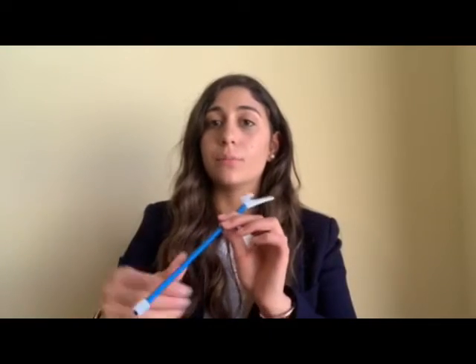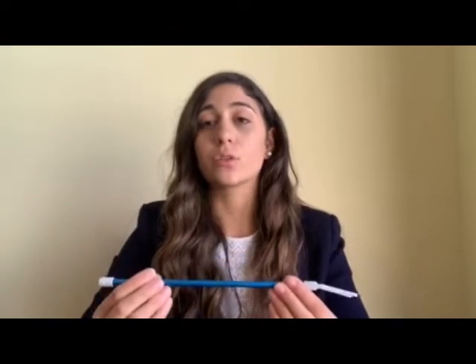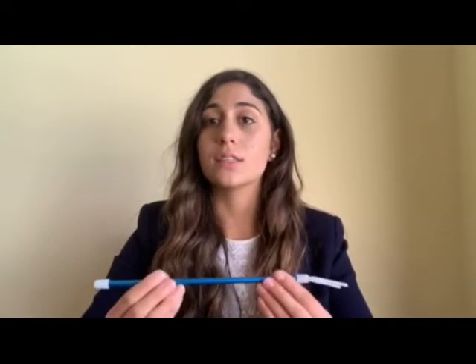These patients spend most of their day in a hospital bed with little to do. They do have an iPad set up in front of them that they can use for entertainment, research, and reaching out to family and friends. Currently, they access this iPad using a rigid mouse stick that they simply insert into their mouth and use to tap on the screen. This is slightly impractical for them because they also use the stick to reach different buttons along the side of their bed, such as ones that adjust their bed height, call their nurse, and also do other functions.